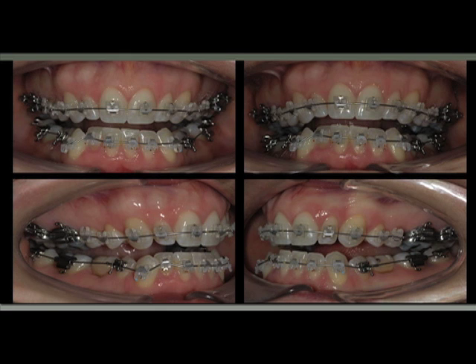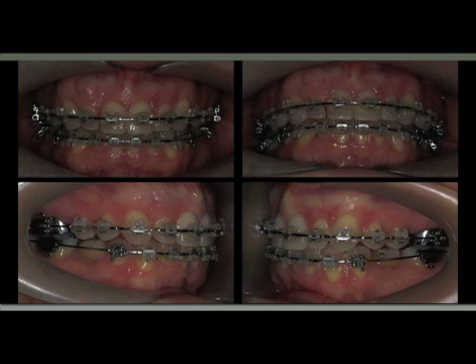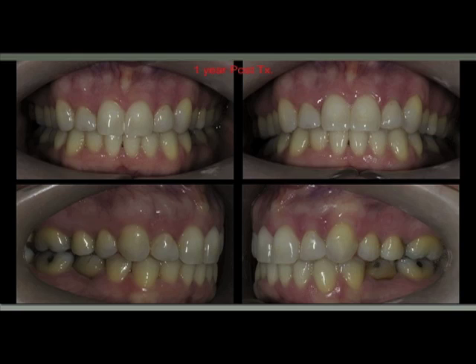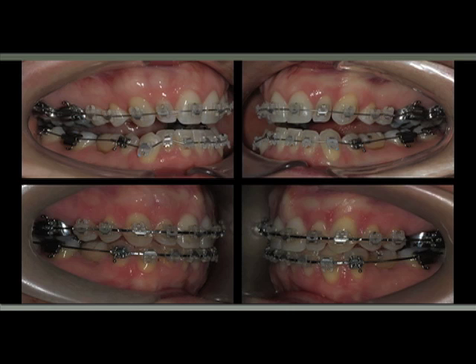So we will not review wire by wire as we usually do in the courses. We will just go from this wire, the first one, to the last wire over here. And you can see that the bite is closed, the occlusal plane is level, and we have a better overbite, overjet and a better intercuspation. So the idea, as you can see here with the finished case, you can see how the bite is closed. You can see here after 1 year post treatment.